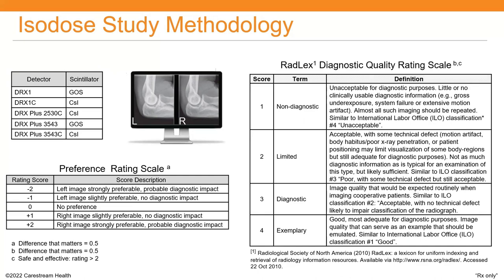The image pairs consisted of an image processed with default EVP Plus processing, which includes traditional noise suppression that is standard with the EVP Plus processing, and the image processed with smart noise cancellation with the EVP Plus processing modified, so that the noise suppression was disabled and the sharpness was tuned to be consistent with the sharpness appearance of the default processing. Images were randomly placed left or right and were presented in a random fashion in a work list for the readers, with the treatment conditions blinded to them, and each radiologist had a different work list order.